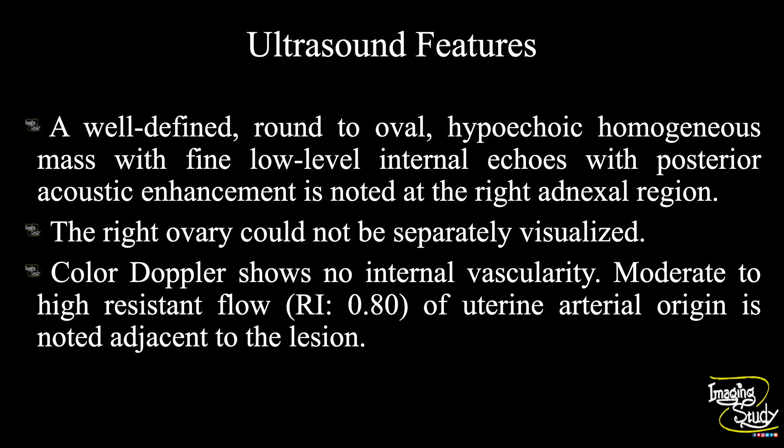In summary, a well-defined round to oval hypoechoic homogeneous area with fine low-level internal echoes and posterior acoustic enhancement is noted at the right adnexal region. The right ovary could not be separately visualized.